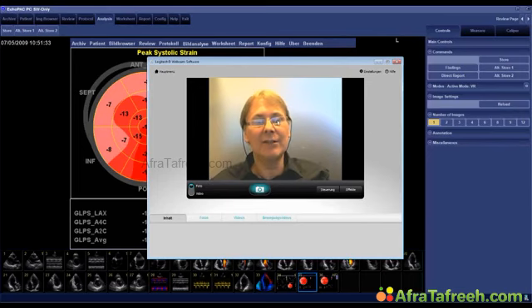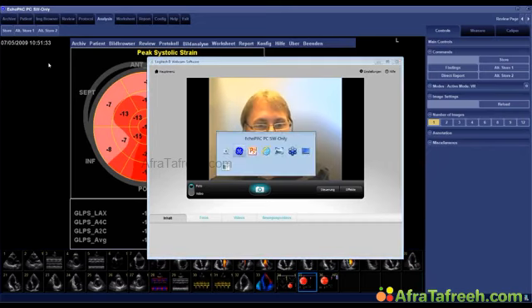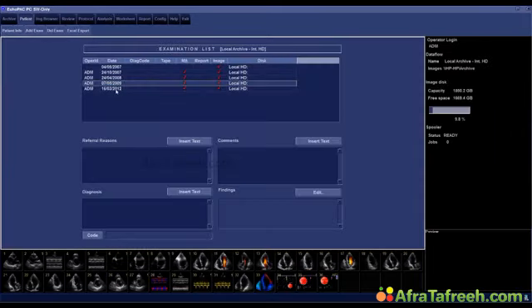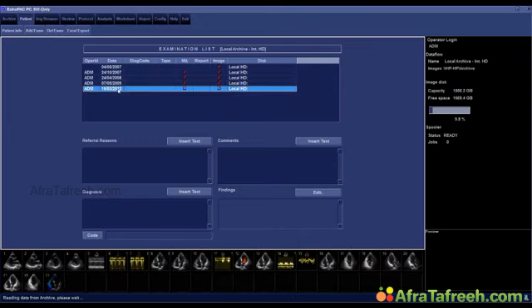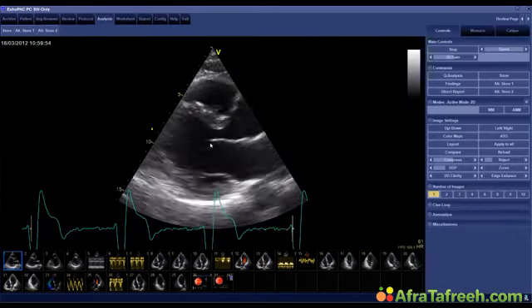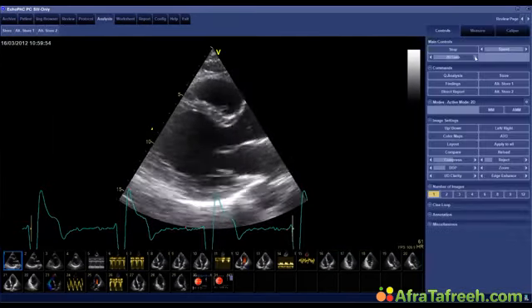Why can't I fly? And we talked back with the authorities and decided, okay, we'll just closely check on him and let's see how he's doing. But at this point, we'll still let him fly. And the study we performed next was in 2010 and one in 2011. And I'll show you just the last study we performed, which was in 2012, just to give you a feeling of how he is actually developing.